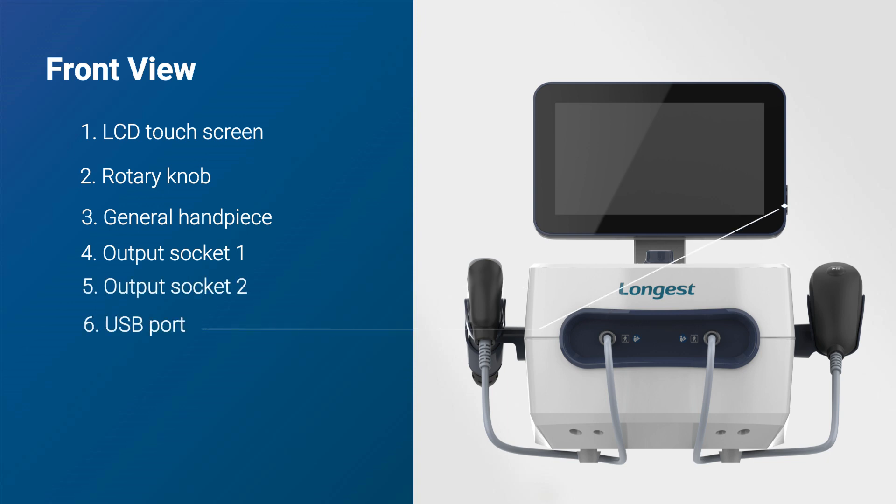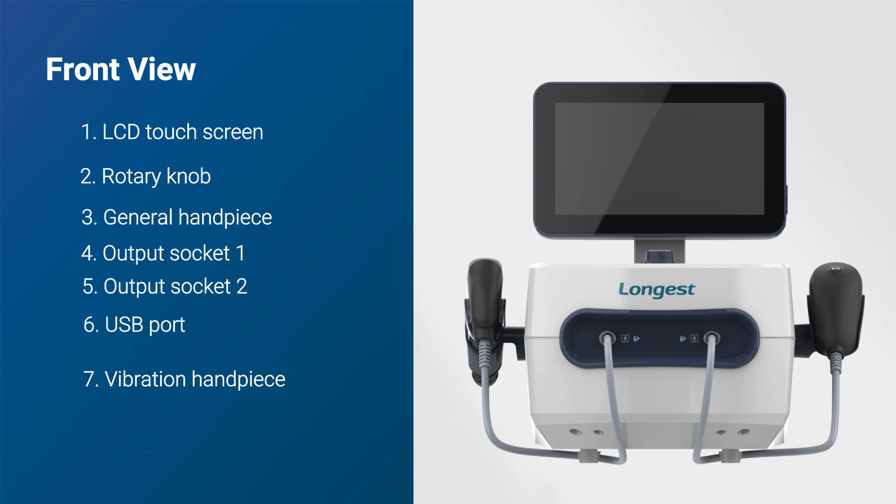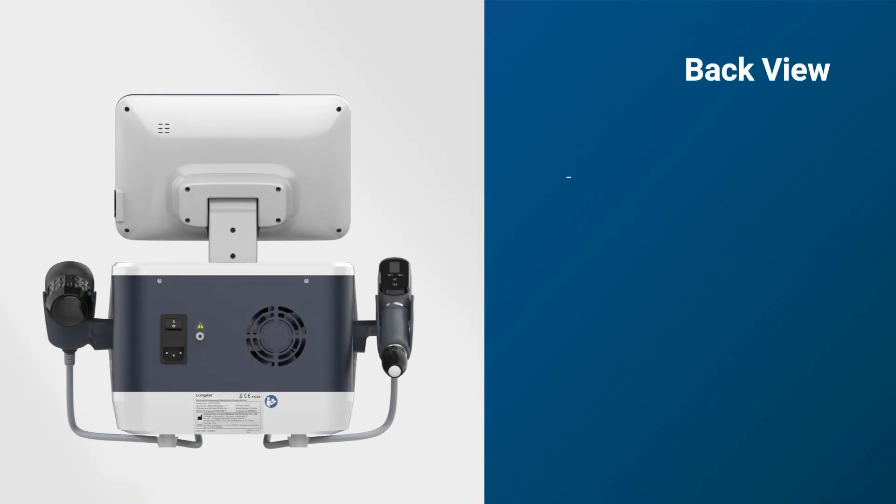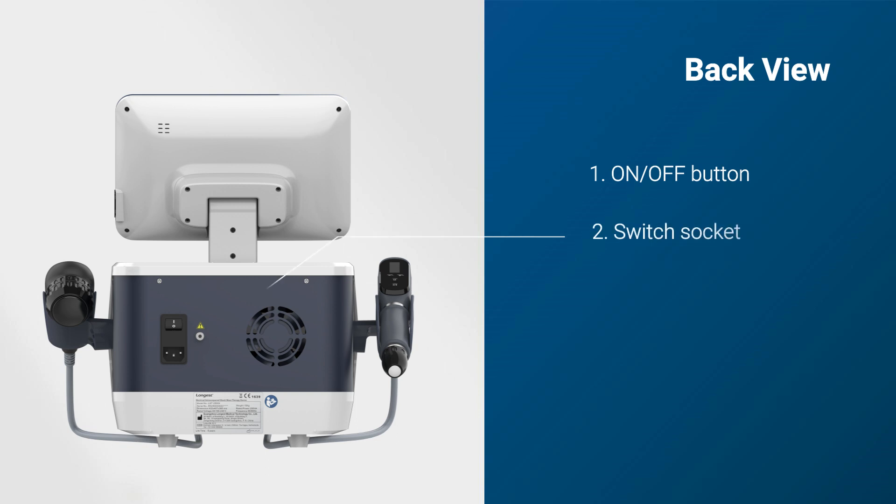Attached to the main unit, we have a general handpiece and a vibration handpiece. This is the back view of the device where we can find the on-off button, switch socket, and cooling fan.